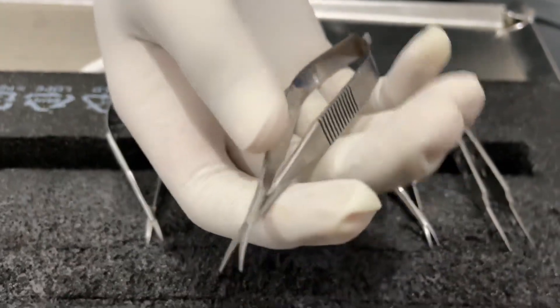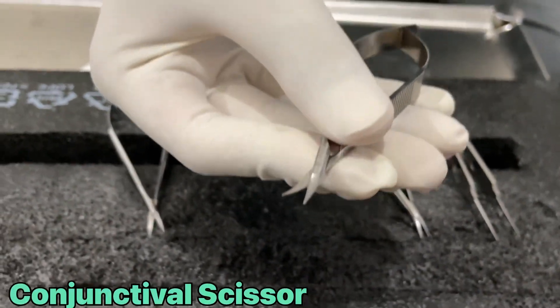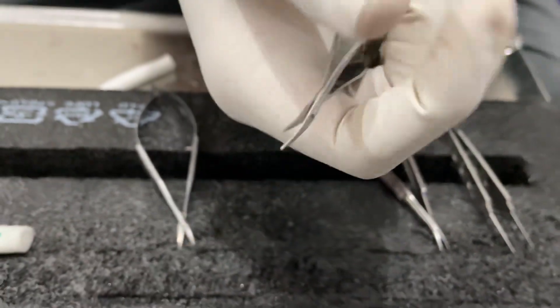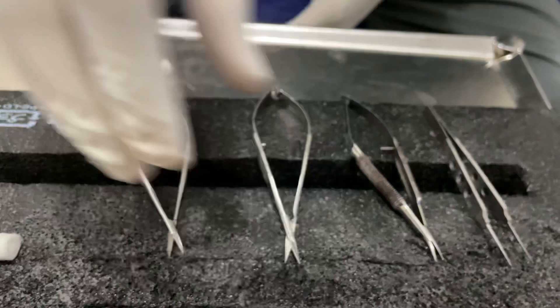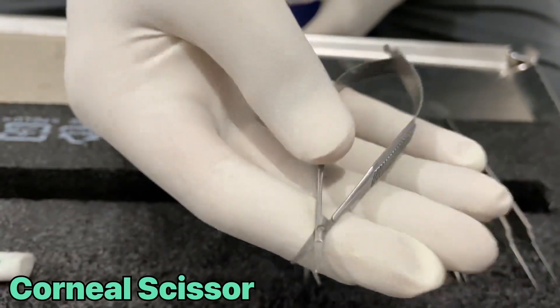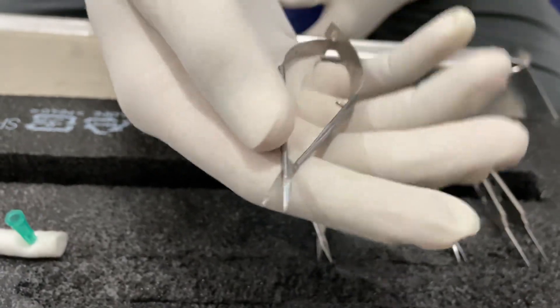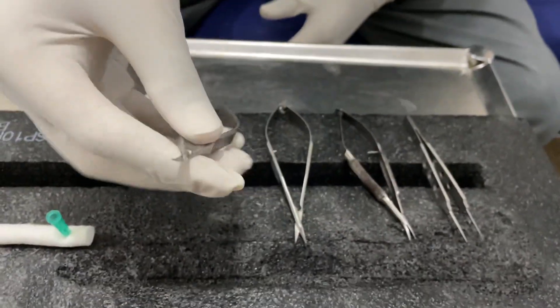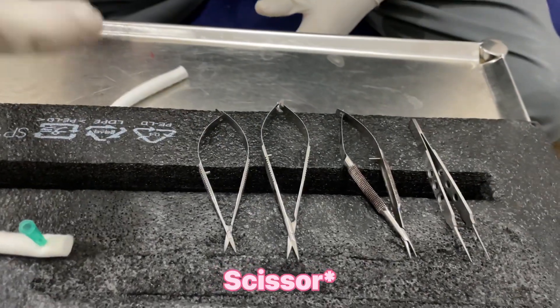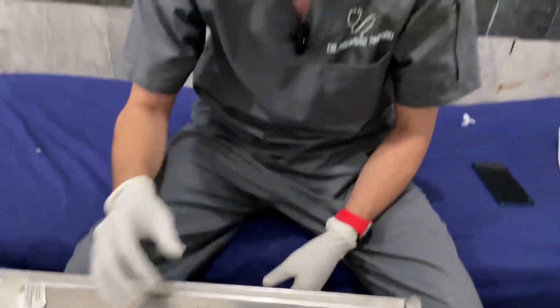This is a conjunctival scissor, which is used for cutting. This is the conjunctival scissor. This is the corneal scissor. For cutting the suture, we can cut with the corneal scissor, conjunctival scissor, or also by a simple scissor.